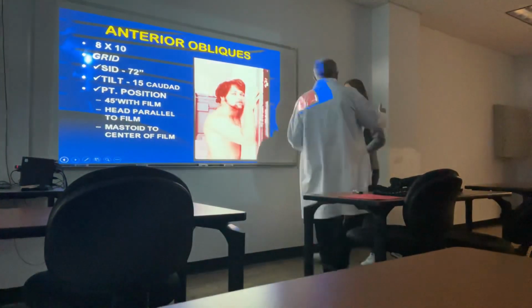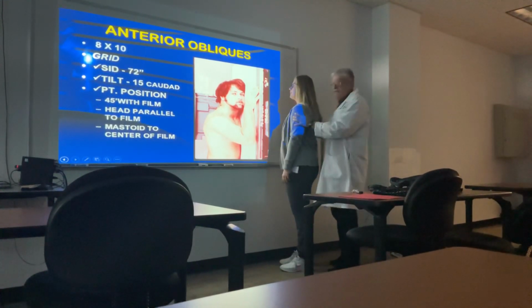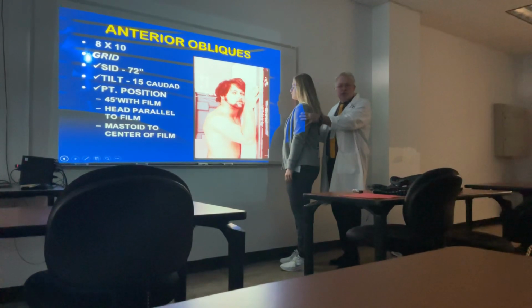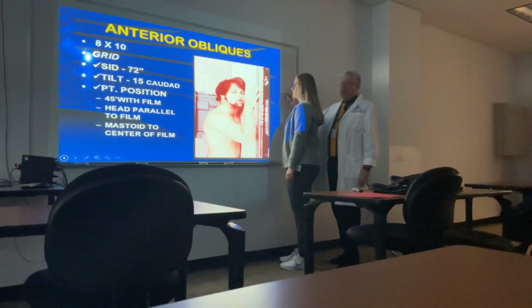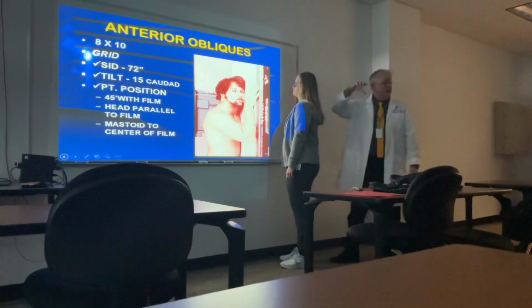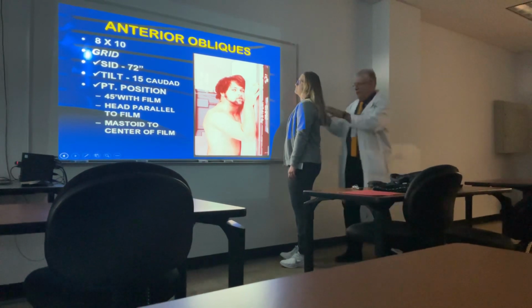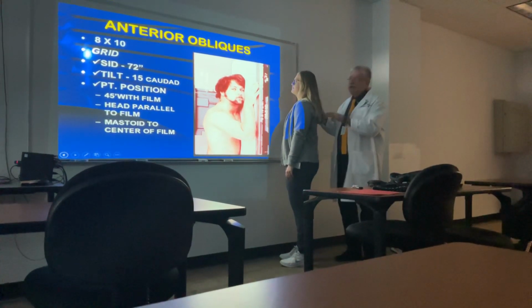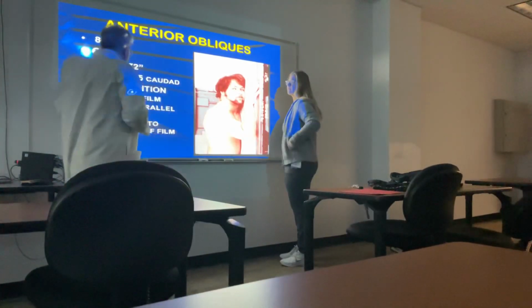Okay, let me stand you, turn you just like so. She's at 45 degrees, yes? Which shoulder is closest to this? The right side. Which marker goes here? Right. So it says anterior obliques, and we can choose how we do anterior obliques. So we've got her position to do an anterior oblique view. The teaching point is, put a big mark, a star, beside this.